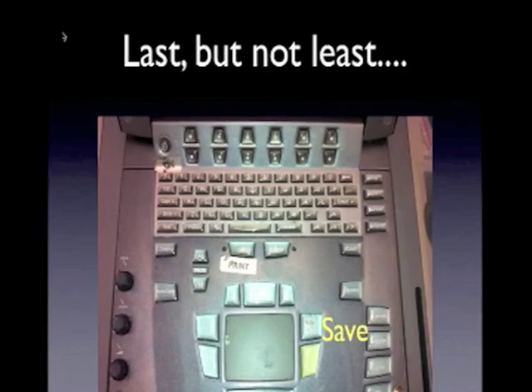Last but not least, don't forget to save your images.